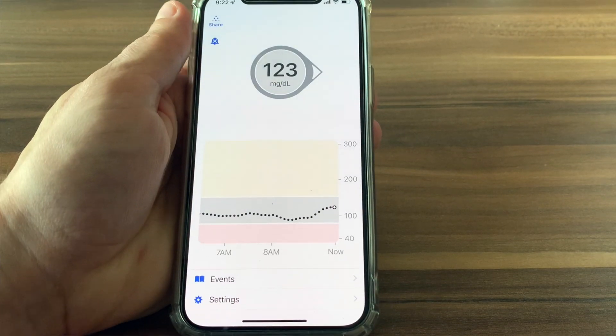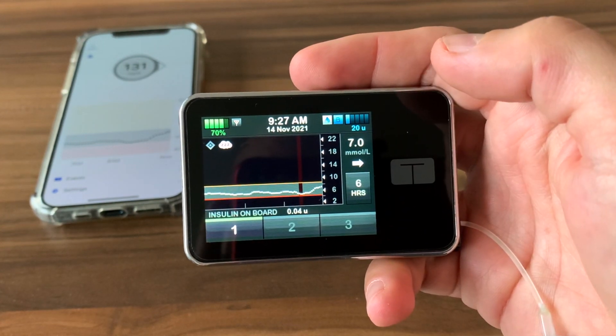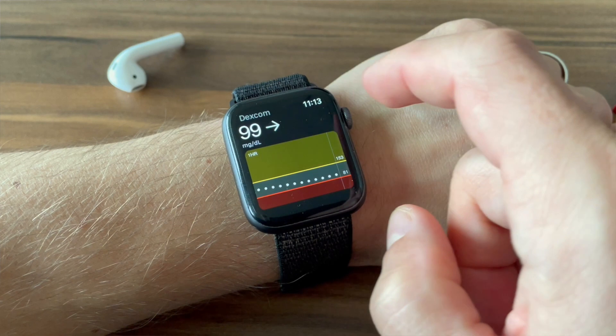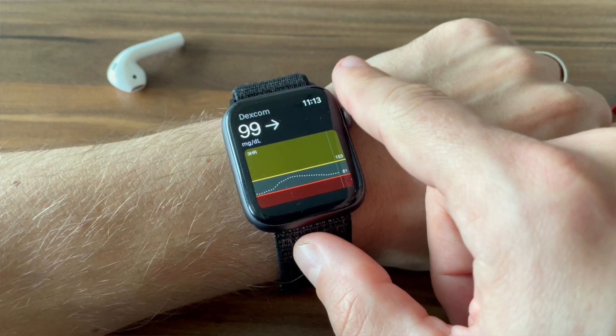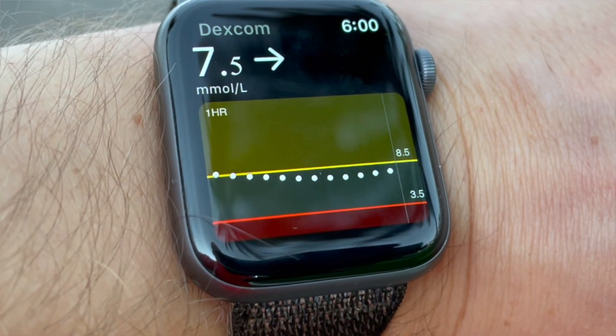Next topic I want to cover is receiving devices and integration, and this is an area where Dexcom G6 blows Freestyle Libre 3 out of the water. With Libre 3, the only device you can use to receive the data from the sensor is your phone. With Dexcom G6 you can use your phone, a dedicated CGM reader, or view your glucose data on your smartwatches and insulin pumps. I get my blood glucose readings on my Apple Watch, and so when I'm using Dexcom, I'm able to check my glucose value and graph all the time just by taking a quick glance at my wrist, as long as my phone is within Bluetooth reach as well. Libre 3 doesn't let me do that.